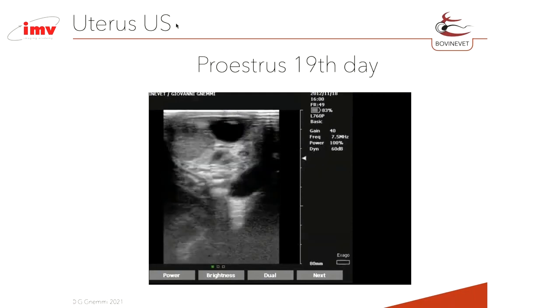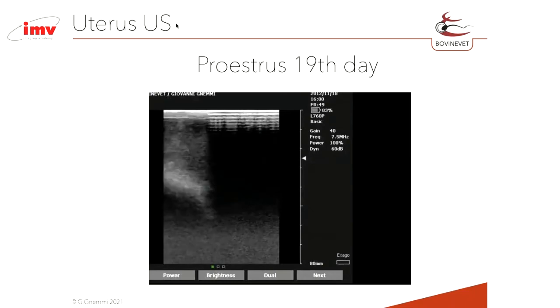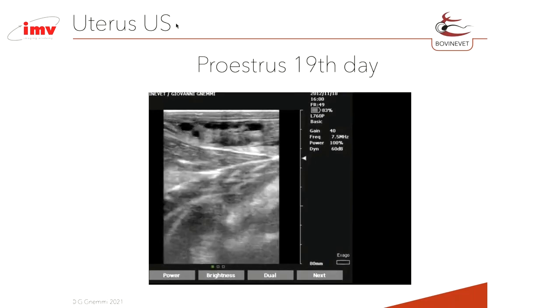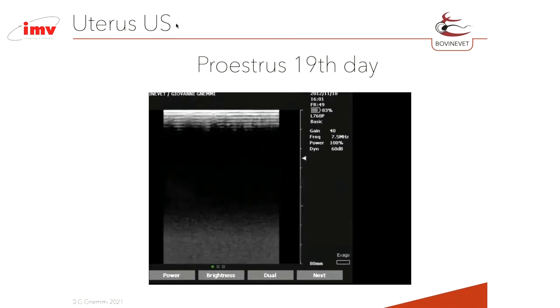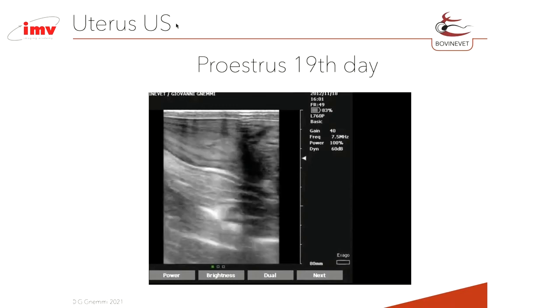The level of the estrogen is very, very high. We have 2 dominant follicles, one bigger, that is the second dominant follicle, the last dominant follicle in case of three follicular wave cows is the third one. And then we have a smaller one, that is the dominant follicle of the first follicular wave, or first and second in three follicular wave cows.